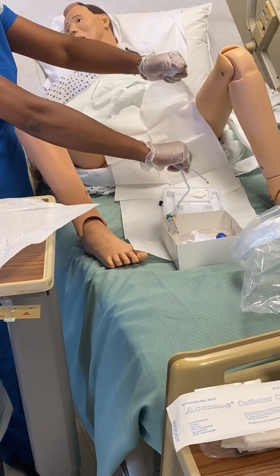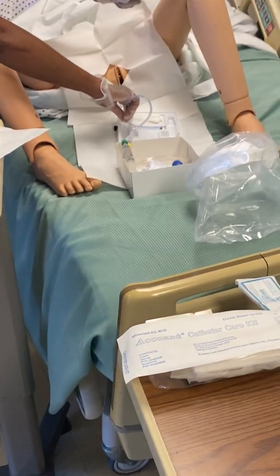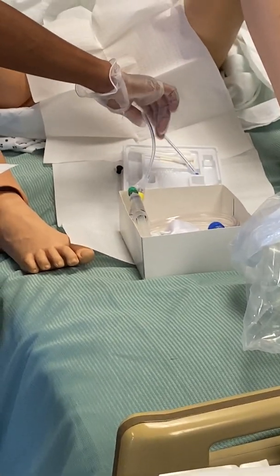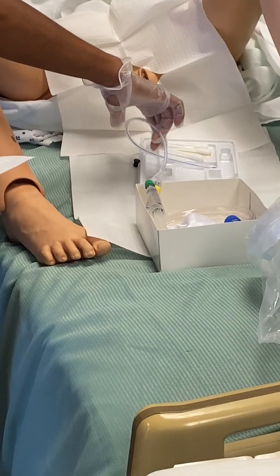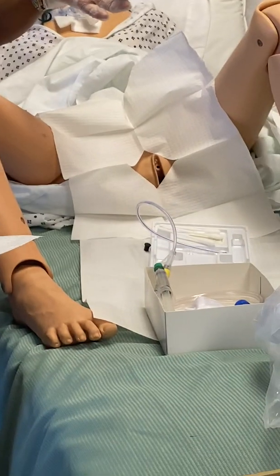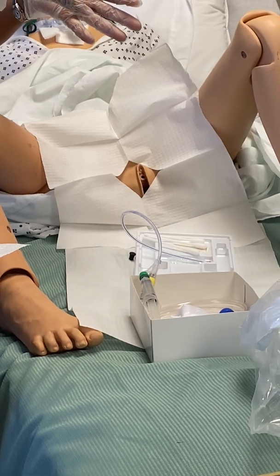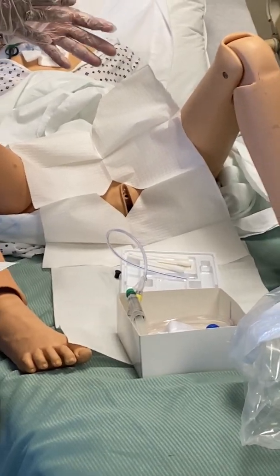All right. And we're going to sit that right there. Okay? So we can get lubricated. Okay? And we're going to hope that it just stays there. Does it sometimes want to flop? Oh, yeah, it does. Okay? And I'm going to come around back and drop. Okay? So, what are we ready to do now? Clean. We've tested our bulb. We've done everything we should have done.